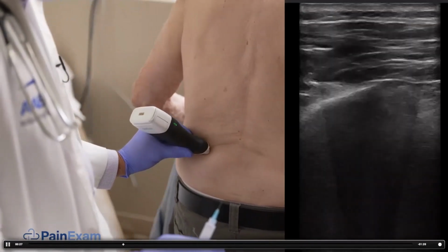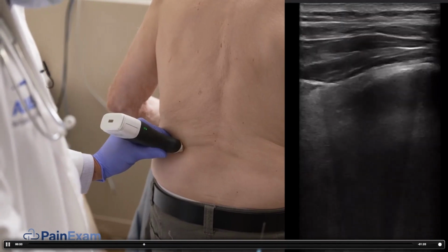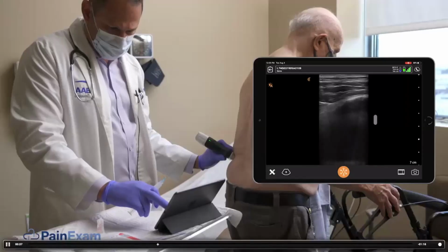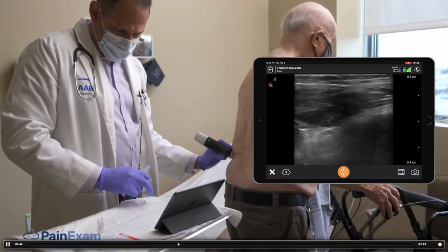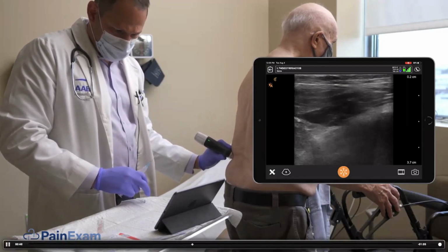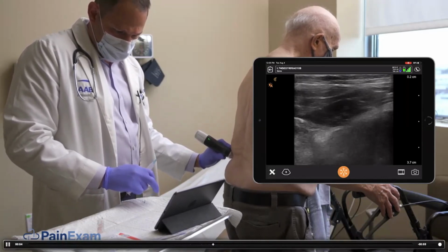One is the iliac crest. So the bone shadow here is the iliac crest. I'm scanning from side to side to identify the nerves. We're too deep, so I'm going to reduce the depth. And right here is a lateral branch of the superior cluneal nerve, which is right over the patient's tender spot. This is a cross-section of the nerve.